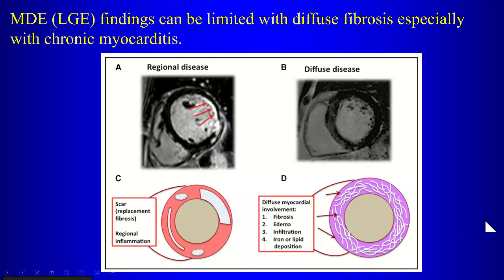But if you have non-ischemic cardiomyopathies, where you have diffuse fibrosis that is uniform throughout the myocardium, then the entire myocardium is abnormal. And when we do our inversion recovery sequences and do myocardial delayed enhancement sequences, looking for abnormal regions of enhancement, what happens is we just wind up suppressing the whole myocardium because all of the myocardium is the same and all of the myocardium is abnormal.